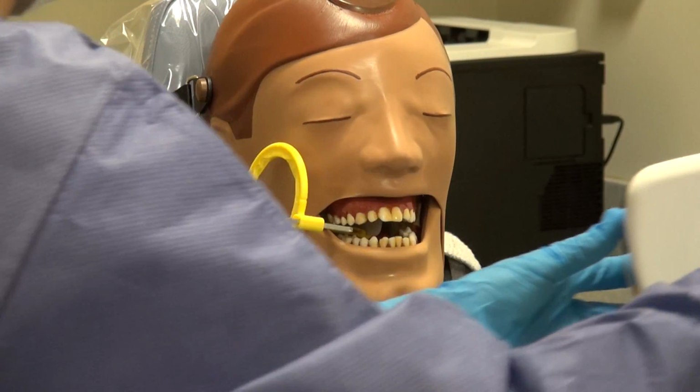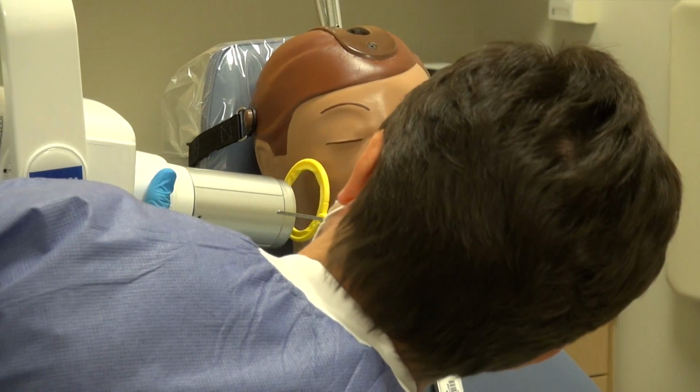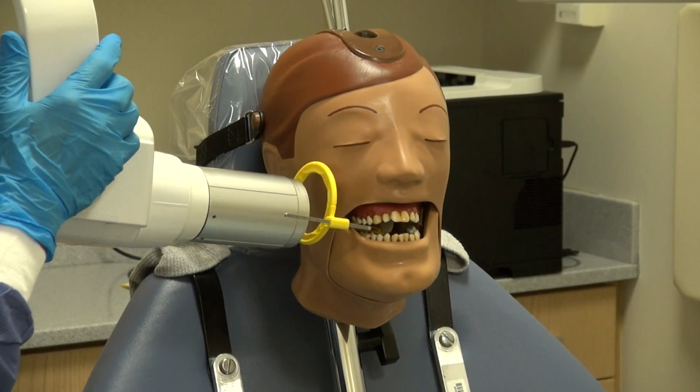Align the PID using vertical angulation, horizontal angulation, and bring to the ring.